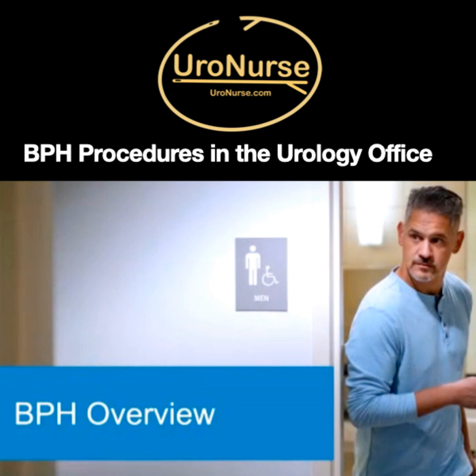You really don't want to overtreat middle lobes or median lobes, because it's like TURPing or lasering and fulgurating a bladder neck for too long. That's where the patients get the really nasty, gnarly, long-term irritative dysuria symptoms. So you want to make sure you treat it, but not overtreat it.